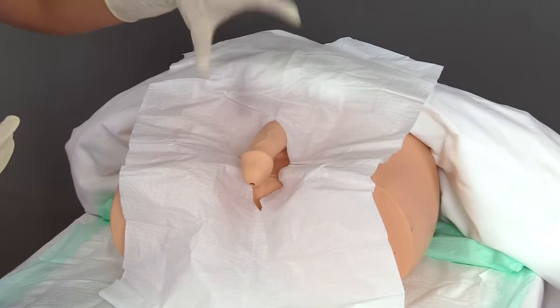Now, if the healthcare provider has ordered lubricant to be instilled inside the urinary meatus, this is when you would do that. Hold the penis up at about a 90-degree angle, take the prescribed amount of lubricant, insert the tip of the syringe inside the meatus, and slowly instill the prescribed amount. Once done, dispose of the syringe — do not put it back in your tray. If the lubricant contained lidocaine, wait up to three minutes for it to numb the area before inserting.